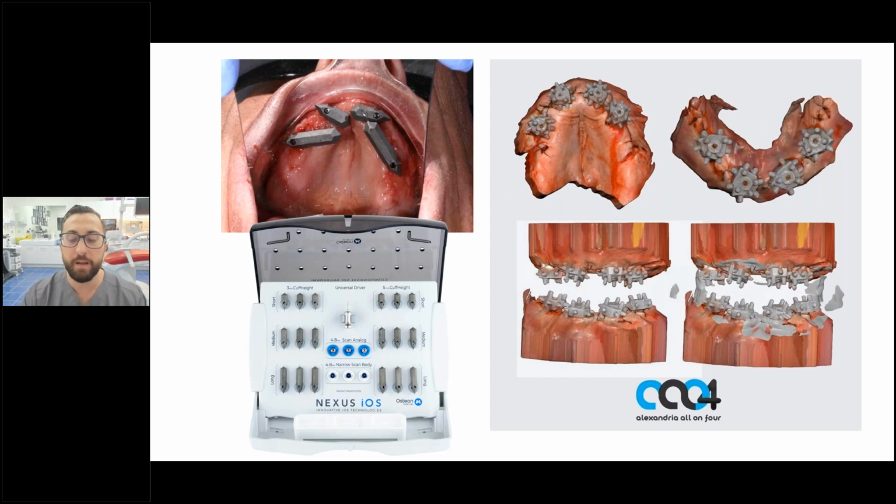And a lot of different companies are trying to innovate on this front. I will say, guys, that this is purely for full arch implants. If you are restoring an implant bridge, I have done that many times with a scanner alone, no problem whatsoever.